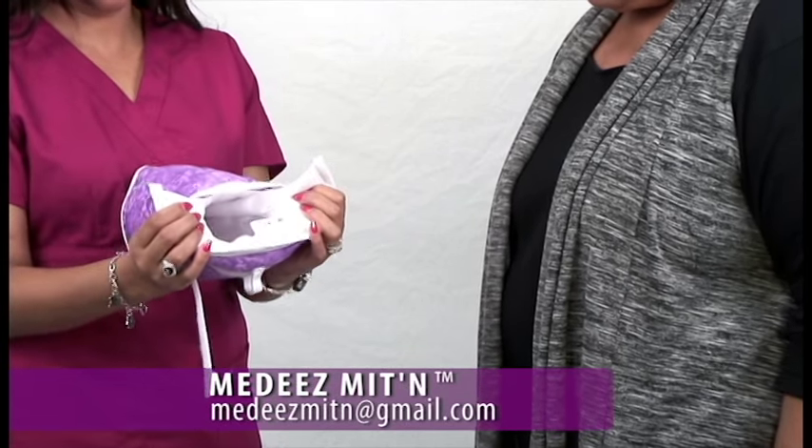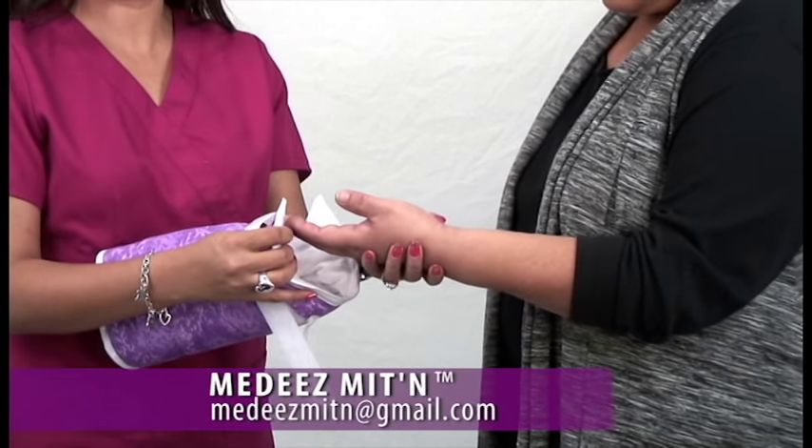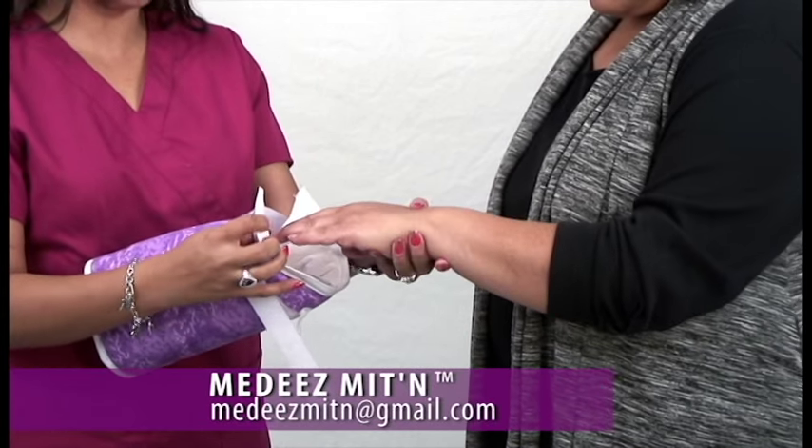Open the mitten wide and insert the patient's hand comfortably. Have the patient insert the hand with the palm facing up or palm facing down.